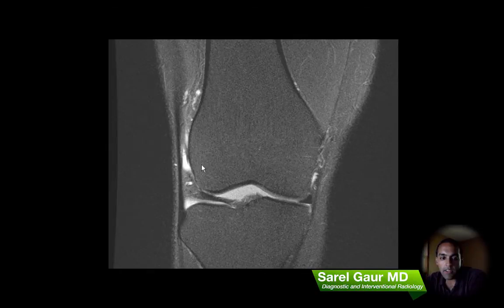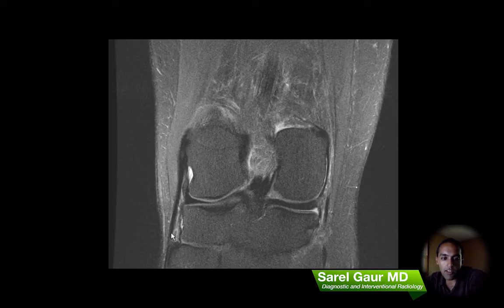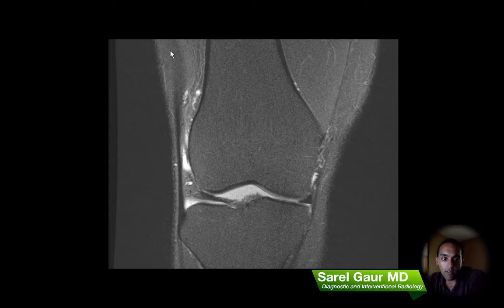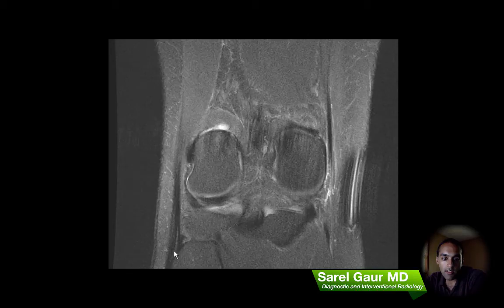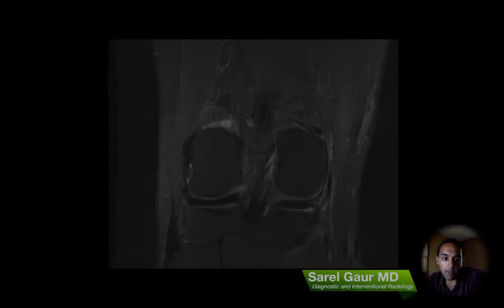Then I go to the lateral supporting structures. Instead of just being one structure like the MCL, there are three on the lateral side. There's the true LCL, which is a ligament going from the femur to the head of the fibula — that's intact. And then there are two tendinous structures: anteriorly we have the IT band or iliotibial band, inserting onto the proximal tibia. And as we come posteriorly, we see this somewhat wide tendon coming off the biceps femoris muscle, inserting there on the head of the fibula.